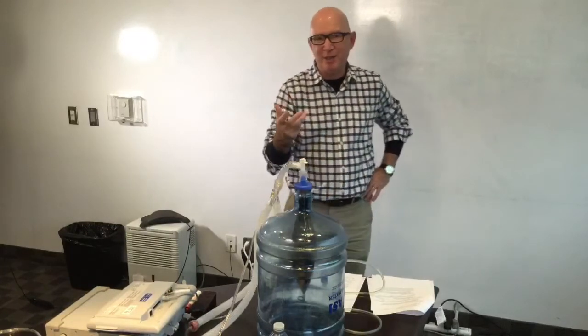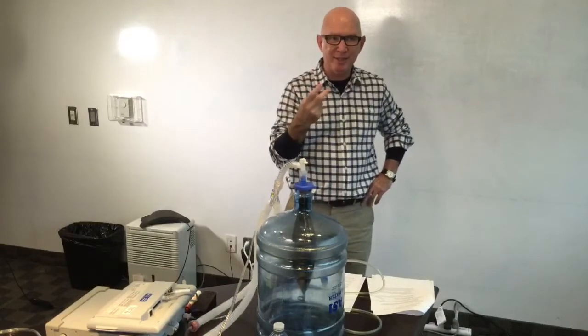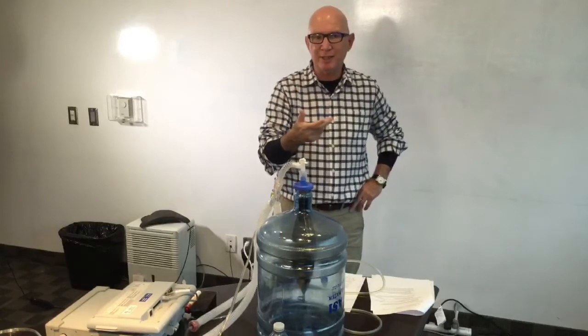So in looking through the medical directives, our recent ones that have been published within Ornge, you'll see in there that SIMV is not an option anymore when it comes to mechanical ventilation. The two options that you have, and I'm pleased to see the second one, the first one is assist control, and the second one is pressure support ventilation.